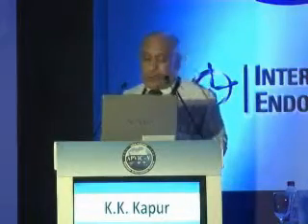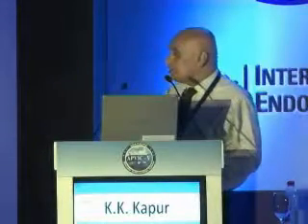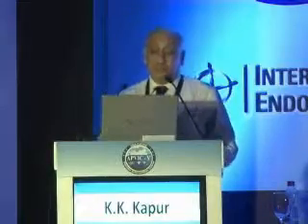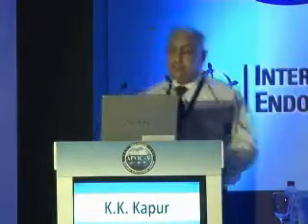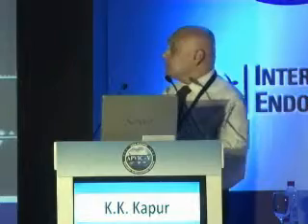Now when you want to augment the flows, you can see that when you compress distally, you will get excellent augmentation. Now this sort of augmentation can also take place if there is a partial block of the deep vein. So if you get this augmentation, it does not always exclude a deep vein thrombosis. A partial block, or when there are extensive venous collaterals available, then you will also get this augmentation.